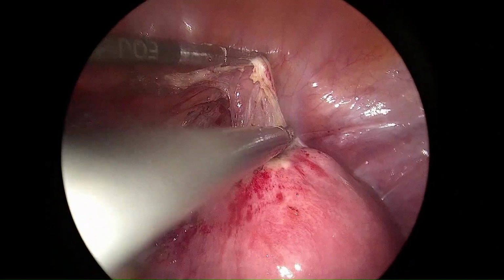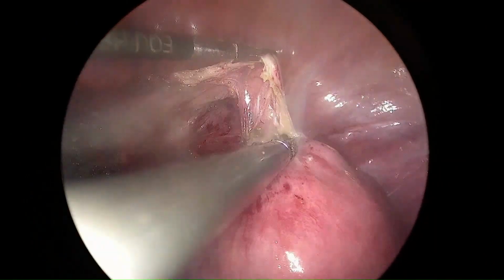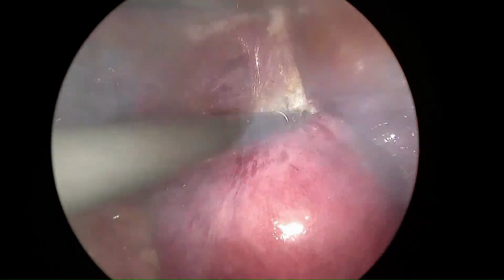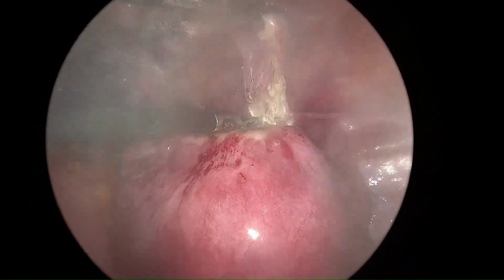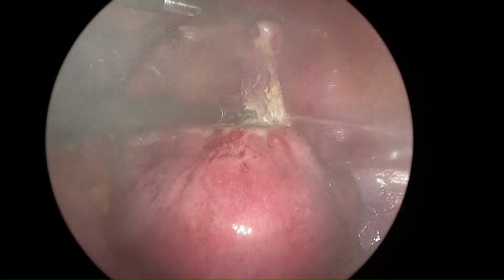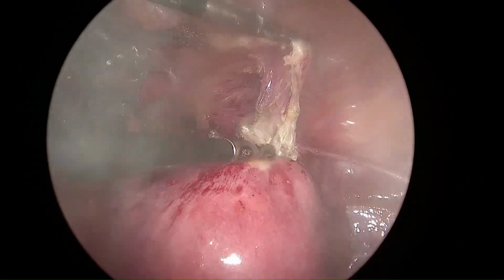Creating this kind of a window will help in separating the bladder from the cervix below, and the only attached portion of the bladder to the scar on the lower uterine segment becomes obvious. Now it's time to cut the scar.